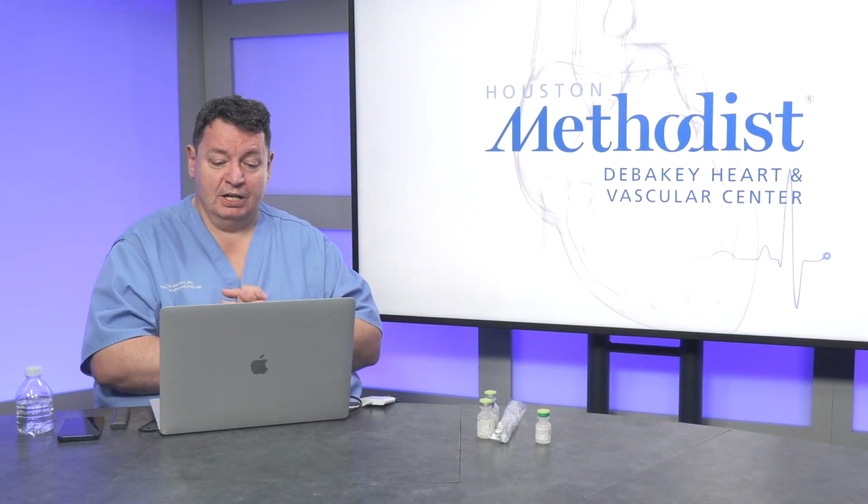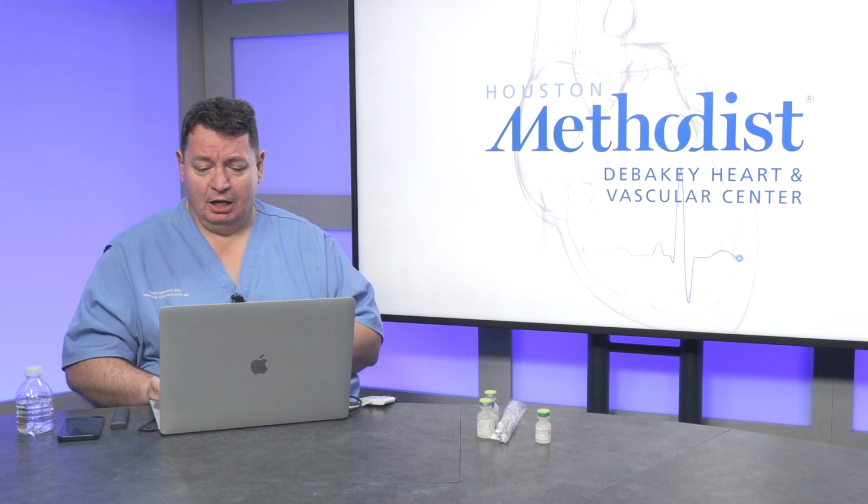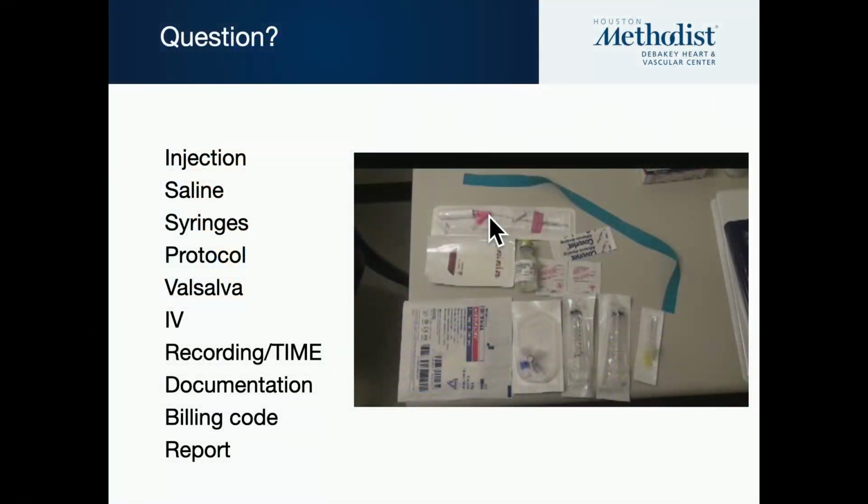And again, Valsalva, IV. So if you don't have a short extension, you have a long extension, think about that also wasting bubbles and wasting injection time. Recording time, remember the 0-0. So when I injected at 0-0, then you know 30 seconds. Documentation wise, 1 injection, you can do with and without Valsalva. Billing code, you guys already know, and make a beautiful report, because I think the TCD is definitely beating the echo any time and any day to detect the right to left shunts.